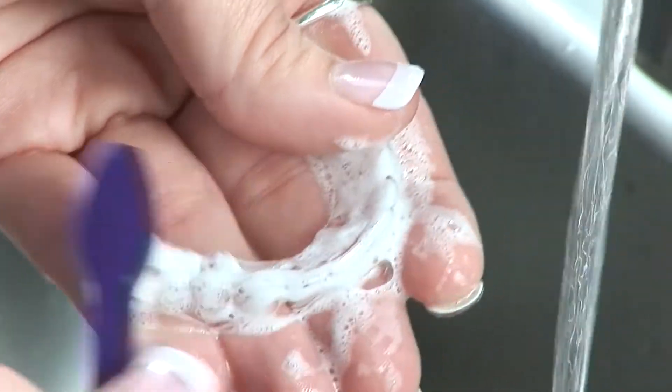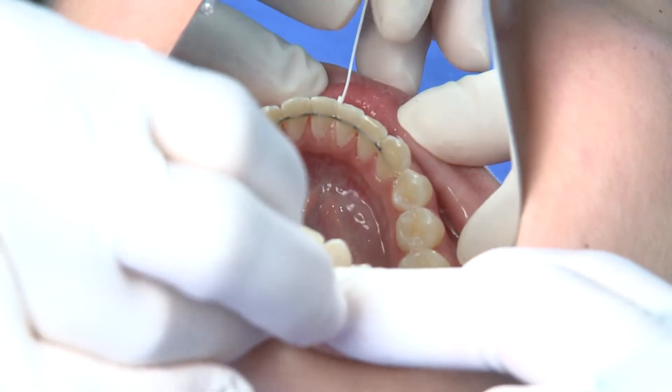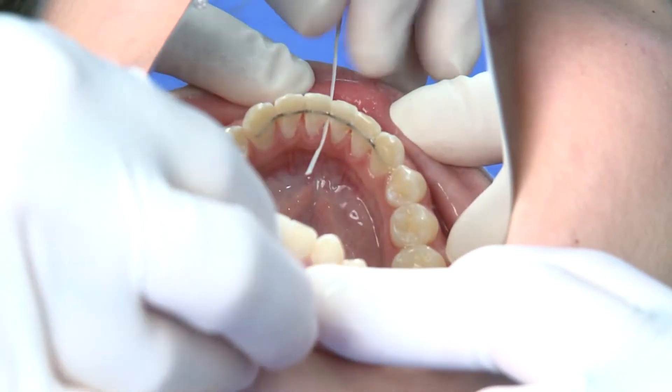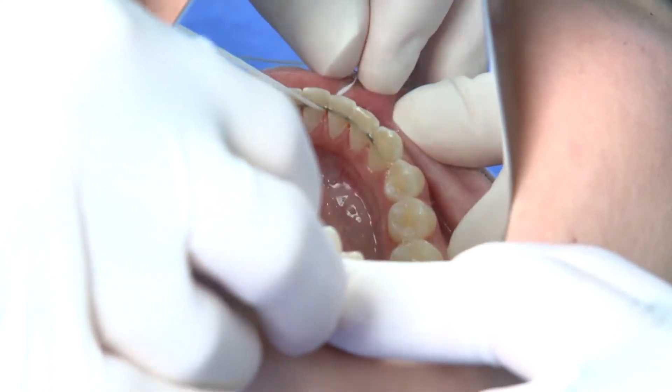If you have a bonded retainer like this, you'll want to carefully brush around it as well as floss. When flossing, be sure to thread the floss carefully under the retainer, then floss where the tooth meets the gum line.